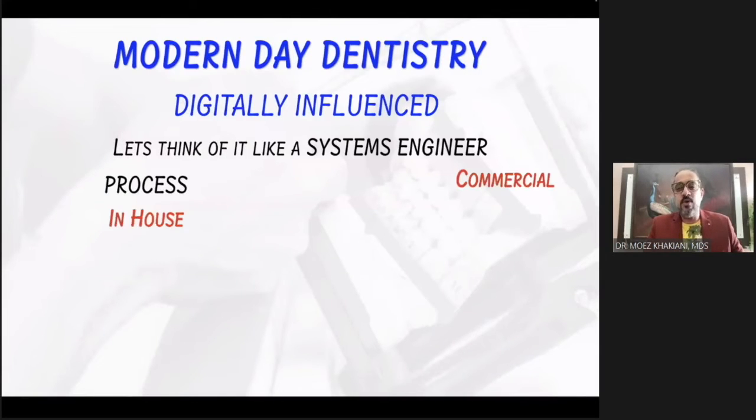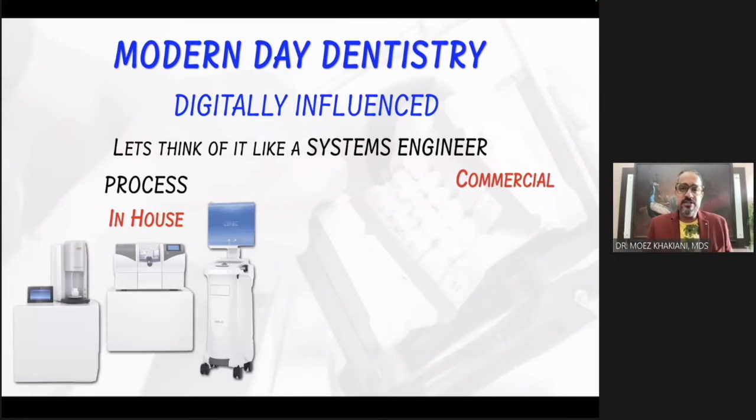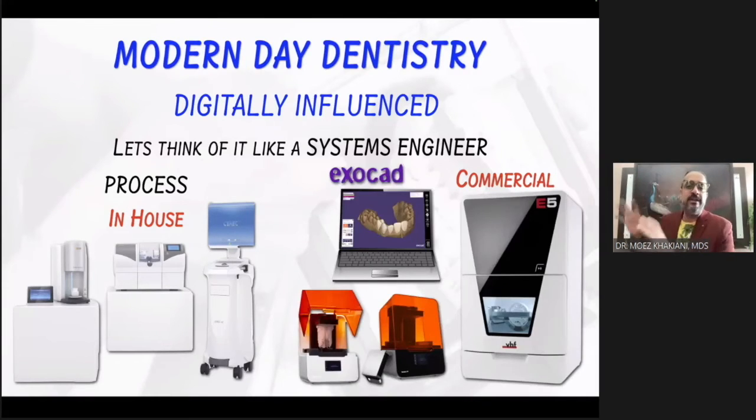When we talk about process, what comes under process? You could have an in-house processing unit, which is nothing but your chair-side system, which can scan and mill both of these together. Or what is something that is more commonly followed when it comes to digital protocol is let the lab make all the investments for digitals. Okay. And today there are so many different laboratories that have invested in intraoral scanners, and they send their boys with the scanners to you. Why would you not want to take the advantage of such a technology available? All right, so go ahead and give it a try.